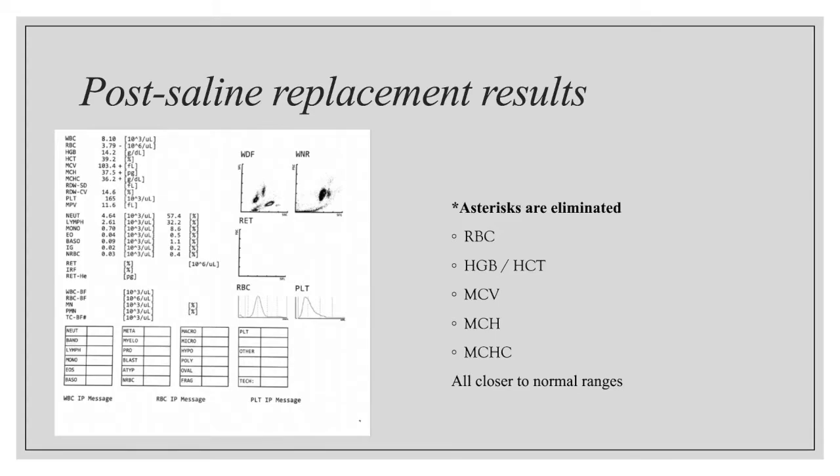Post-saline replacement results clear up all of the asterisks for us. The results are much closer to normal ranges. A few of them still have flags as elevated or decreased, but our error messages have disappeared, indicating that our saline replacement was successful.